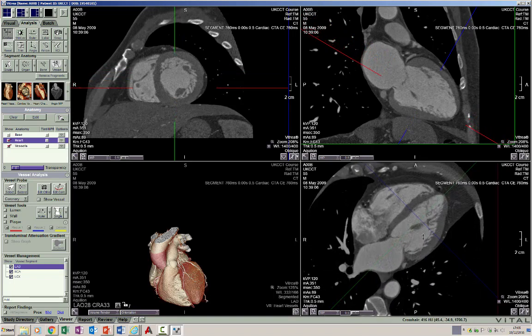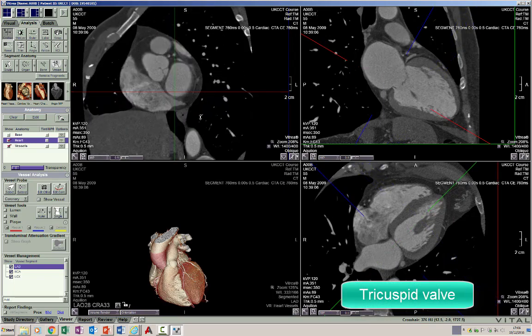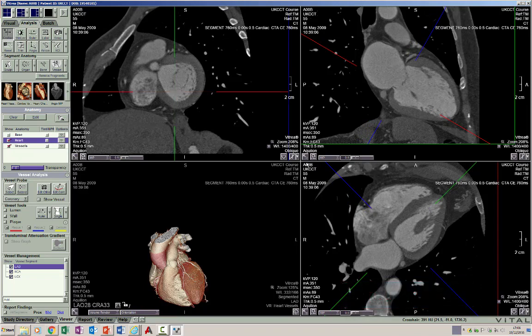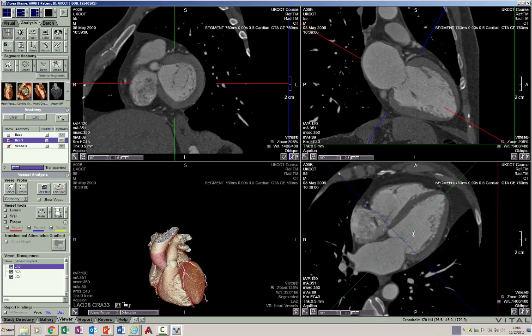The valve of the right ventricle is the tricuspid valve. As the name suggests, it has three leaflets. The leaflets of a normal tricuspid valve are quite thin and hence barely visible on CT scan. One typical feature of the tricuspid valve is that its septal leaflet is more apically placed towards the apex compared to the anterior leaflet of the mitral valve, and the two are separated by the membranous septum, which is part of the ventricular septum.